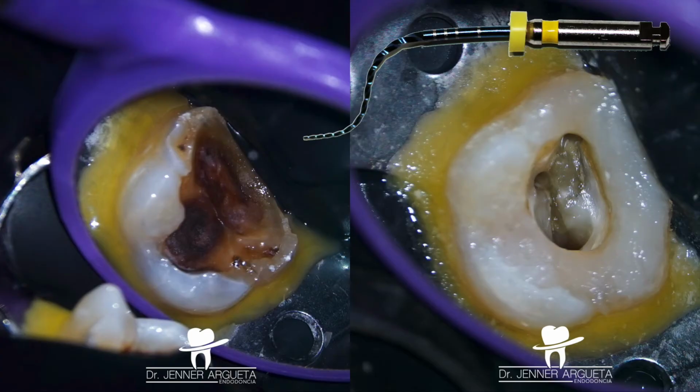Now we have two completely different scenarios. This is the first picture that we took, and this is the picture we took after the pre-endodontic core build-up. As you can see, everything looks cleaner, everything looks healthier, and everything looks much more comfortable to work in.